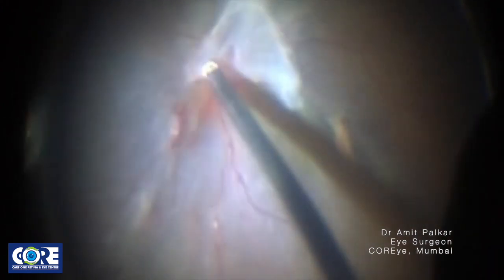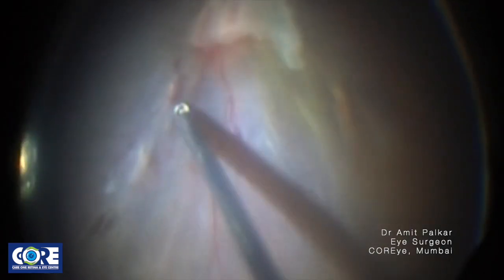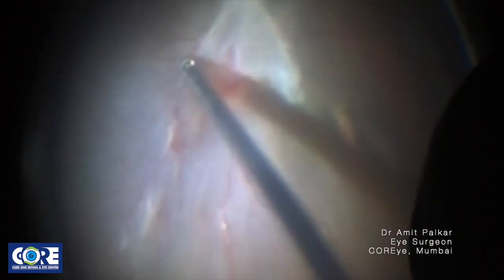I'm trying to go in with the blunt spatula, and that's where I find that it's not just a small attachment. The entire posterior hyaloid is adherent nasally, and that needs to be separated from the retina.